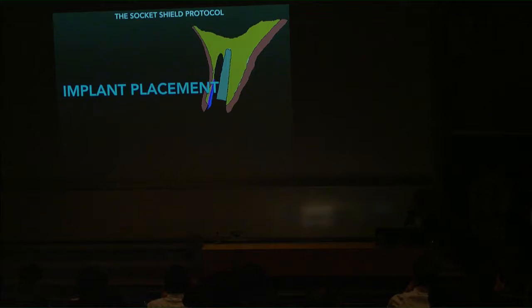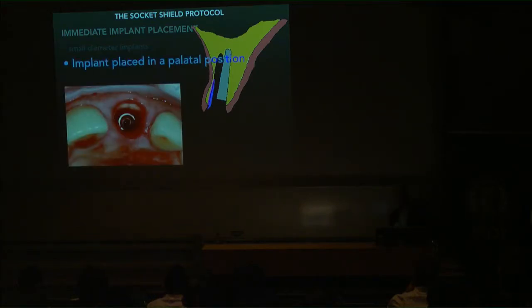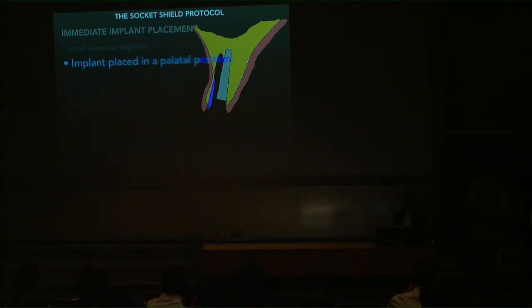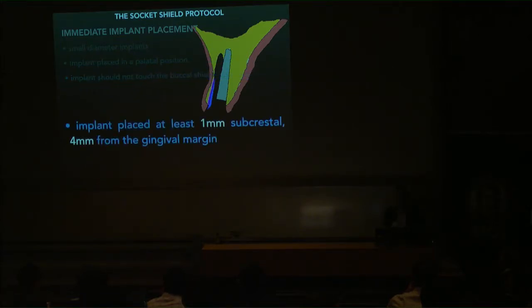Immediate implant position. Implant position should follow the immediate implant protocol as discussed previously. Small diameter implants. Implant head is placed in the palatal position. Implant should not touch the buccal shield. At least 1 millimeter subcrestal placement, 4 millimeter apical to the buccal gingival margin. The smaller the implant diameter and the more palatal the placement, the deeper it should be inserted.